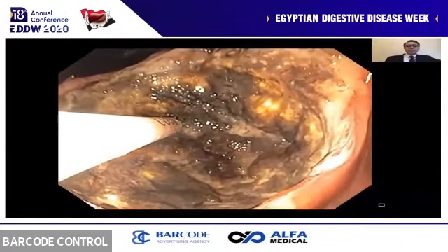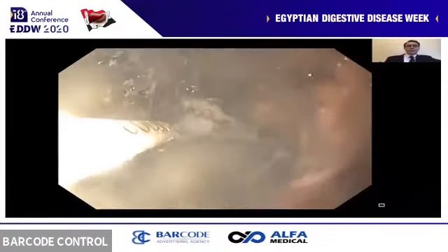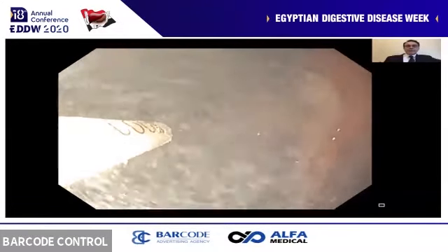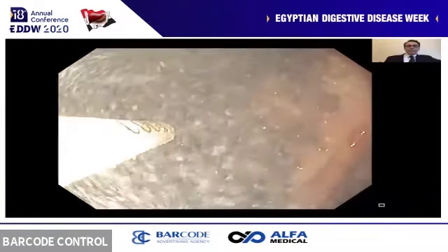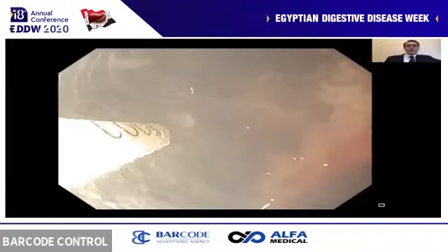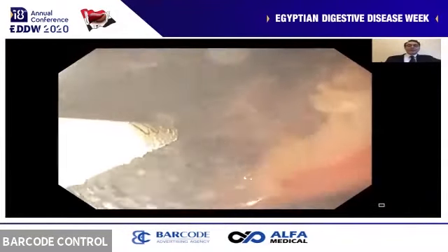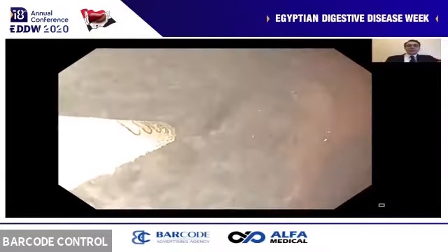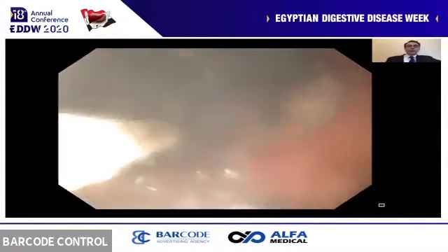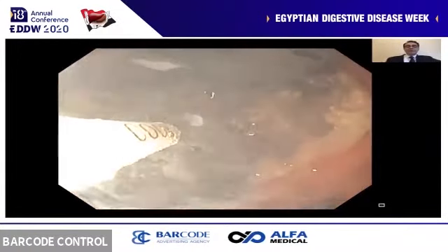use Hemospray, a topical method with this mineral powder. Sorry, so we are applying the Hemospray. Yes, with the Hemospray, the recommendation is that it should be used on the bleeding lesions. However, as long as the surface of the lesion is not dry, as it was not here, the powder will still form a crust, as happened in this case.